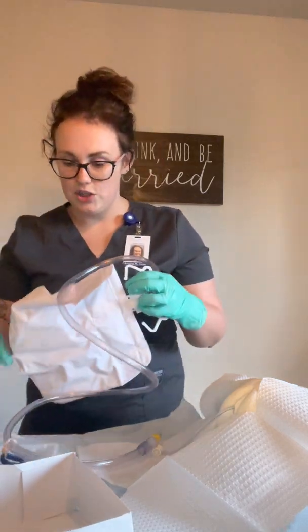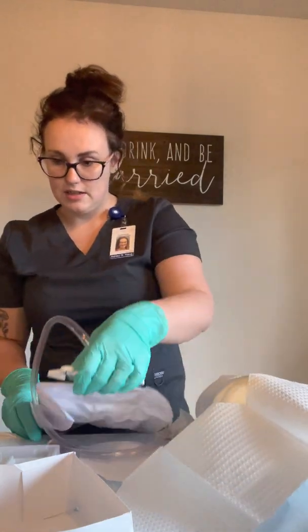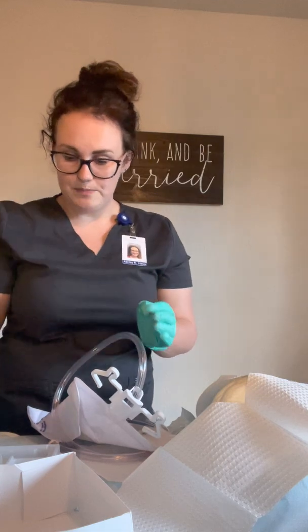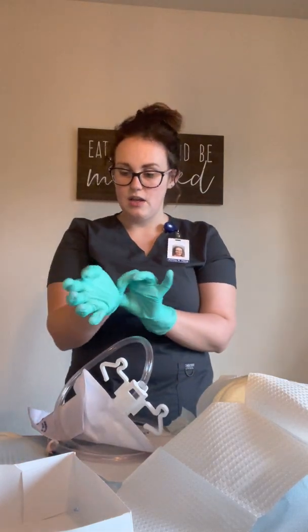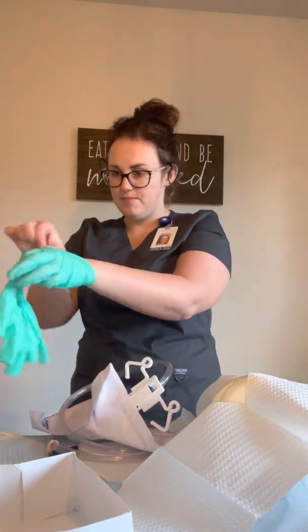Now that I'm finished with that, I'm going to clean up my field, throw away all my garbage. I'm going to remove everything from the site. I will remove my sterile gloves. And then I'm going to wash my hands for the sake of the video with hand sanitizer, but real world, I would be using soap and water and washing my hands at the sink.